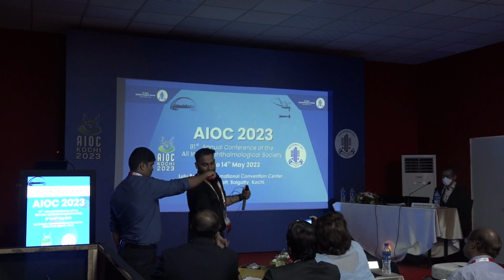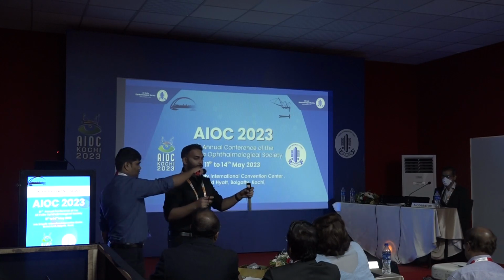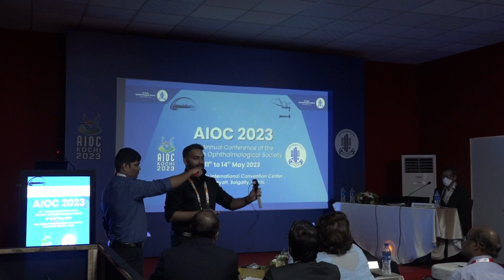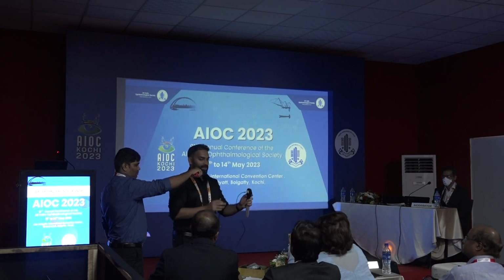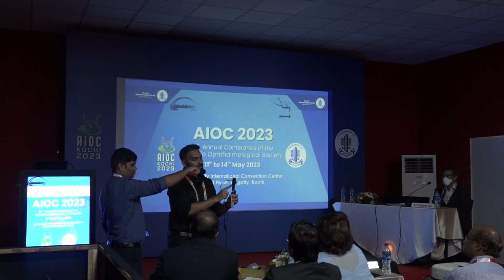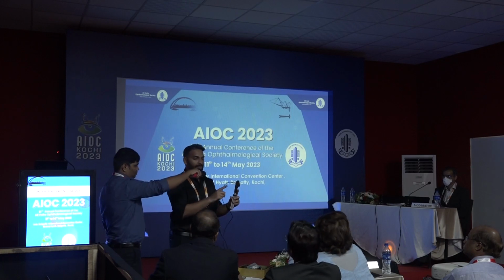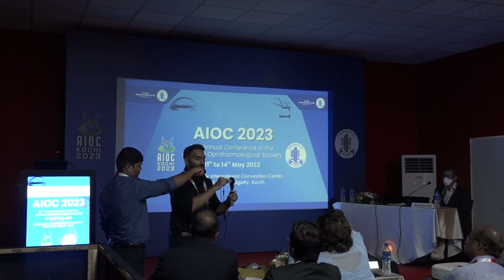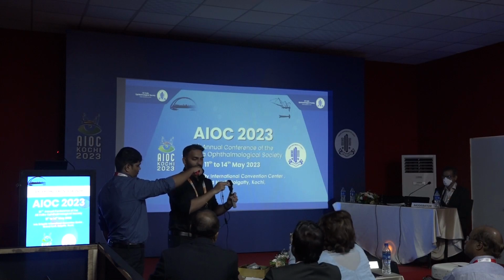And you can connect this to your smartphone. Yes, it fits, and this is the same size. This is the most commonly used retinoscope, the Heine Beta 2000. This is what almost everybody has, except for a few people who use Keeler, so we can design for that also. For now we have this one because this is what we use in our hospital, and so this is fixed.